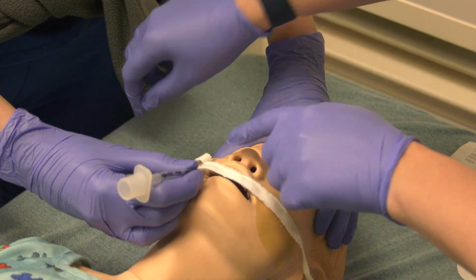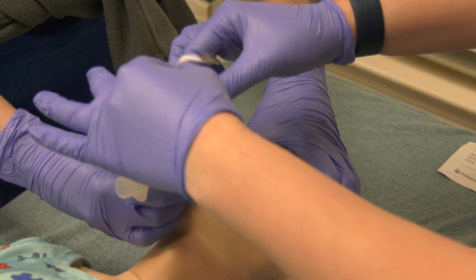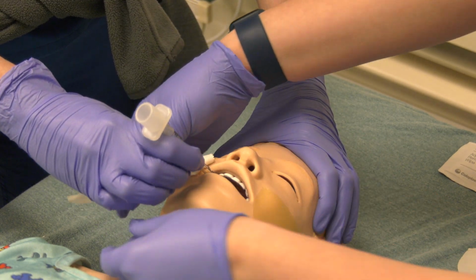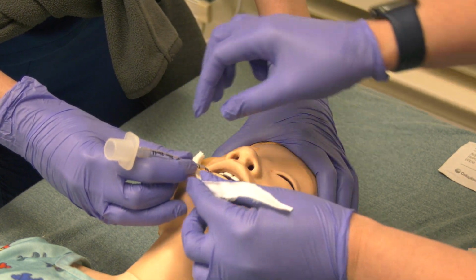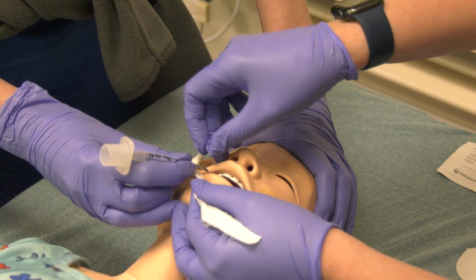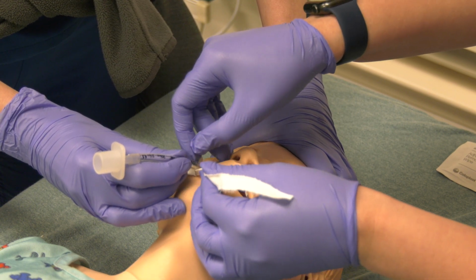With the Y, you want to get as close as possible to the tube. And now I'm going to ask my nurse to adjust the tube slightly so that I can get under. So your first piece will go under the tube, and as always, you want to make sure before putting this first piece down that you are still at 14. I see that we're a little in, so I'm going to move out just a bit.